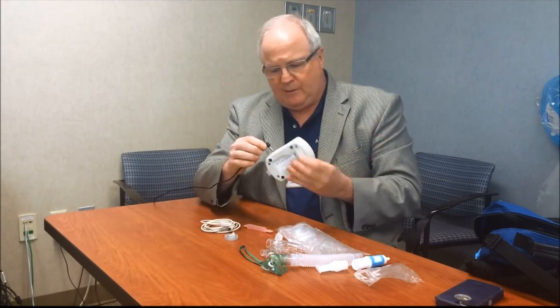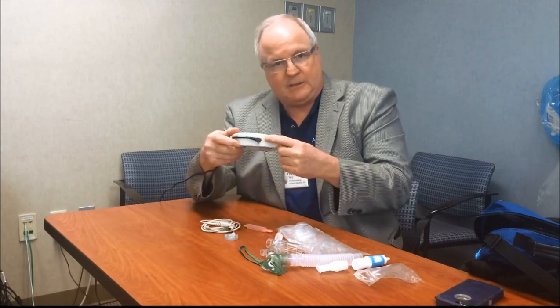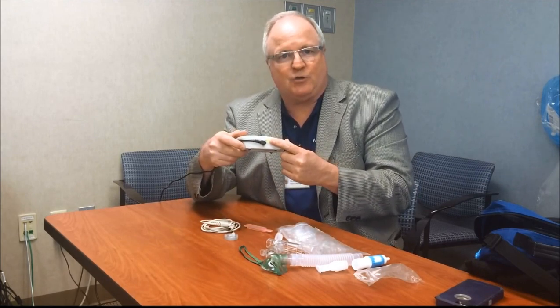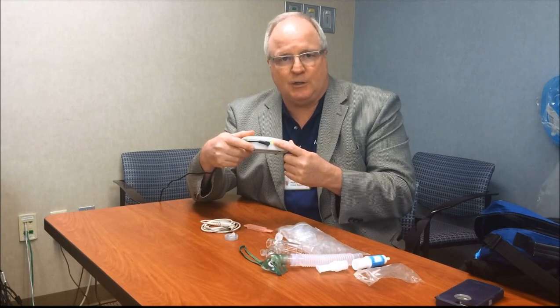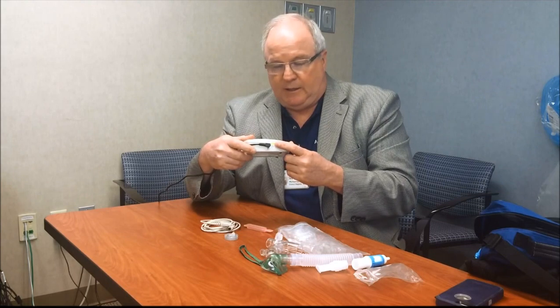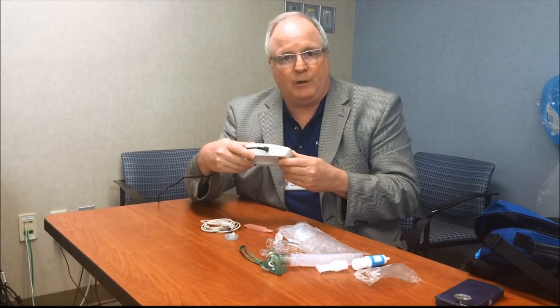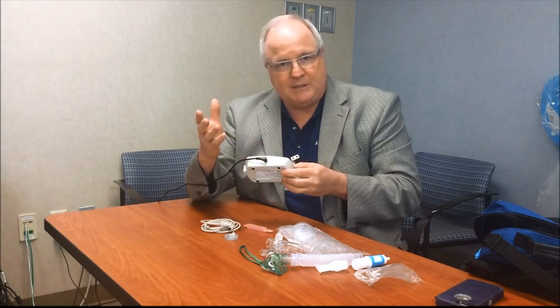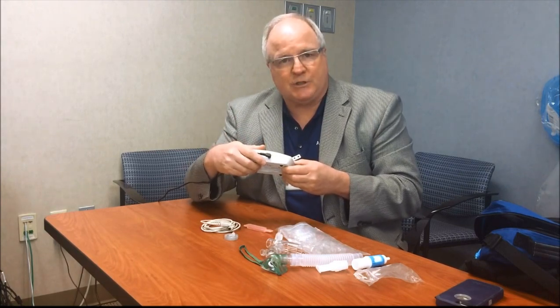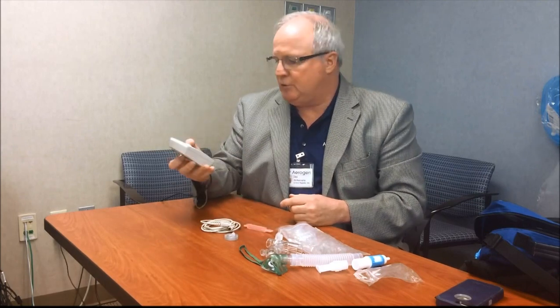So you'll notice I do have a spot to plug this in. Once I plug it in, you'll see it lights either green or amber. If it's green, it means you're fully charged, and it should be capable of going the 40 minutes unplugged. Again, we don't recommend that. We recommend you keep the plug with the unit. That way you will avoid losing it. If it's amber, it means it's not fully charged, but it will still operate. Again, you'd like to have it plugged in order to do that.